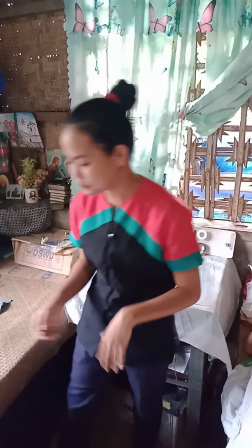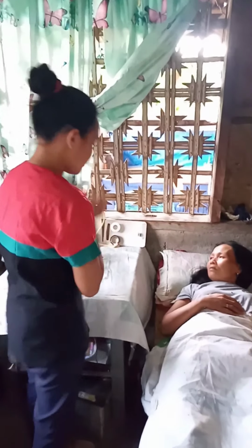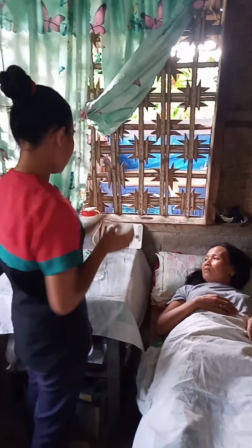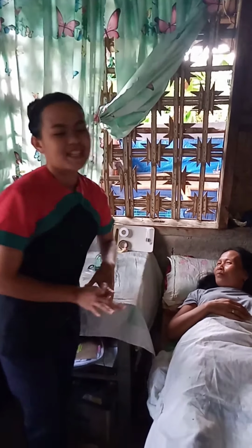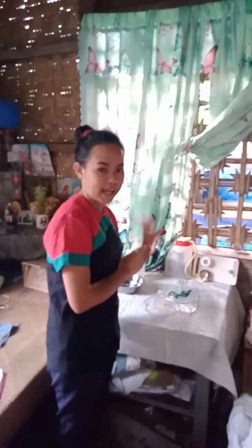Then after that, we really need to check the doctor's order. Then it is time to explain the procedure and hazards to the patient. Good afternoon, ma'am. I am your CNA today. I am Mary Jane Villata Katubig. For today, we will be doing oxygen therapy. Okay, ma'am? Okay.